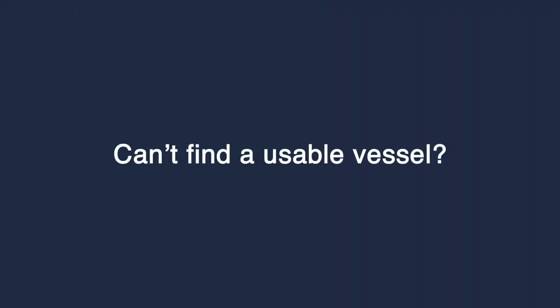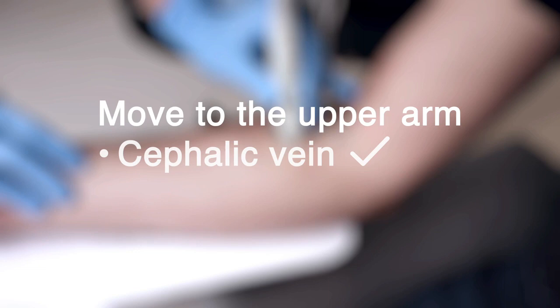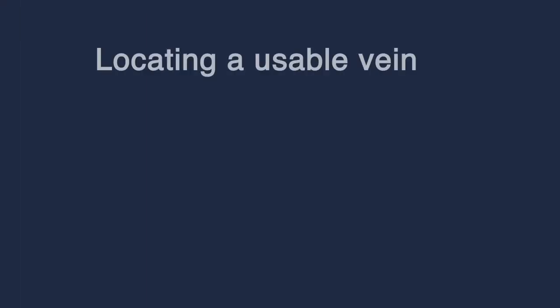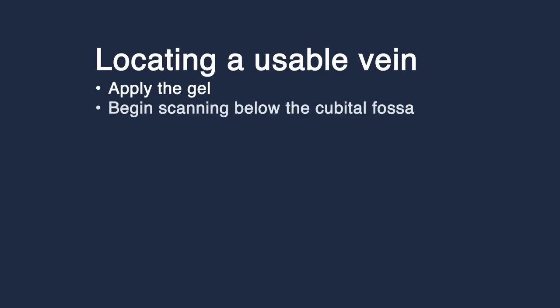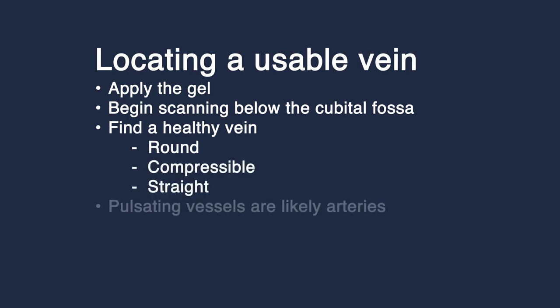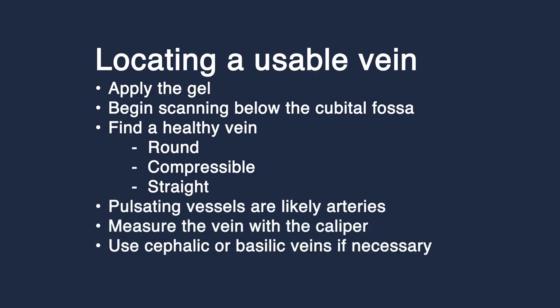If you're unable to visualize a usable vessel in these locations, move to the upper arm and try the cephalic or basilic veins. To recap: apply the gel, begin scanning below the cubital fossa, choose vessels that are round, compressible, and straight in nature. Remember, a pulsating vessel is most likely an artery and is unsuitable. You can measure the vessel with the caliper, and if necessary, you can use the veins in the upper arm.